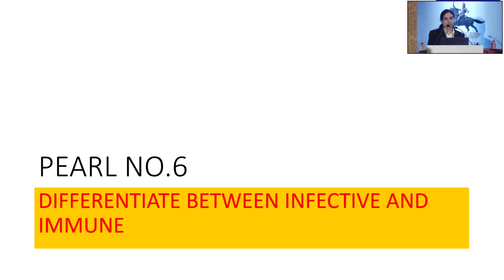So it is very important to get a B scan in these cases. Whenever you are in doubt, do the B scan, and if there is no exudation in the vitreous cavity, it points towards TASS. And you have to see all the patients operated, especially on that day.